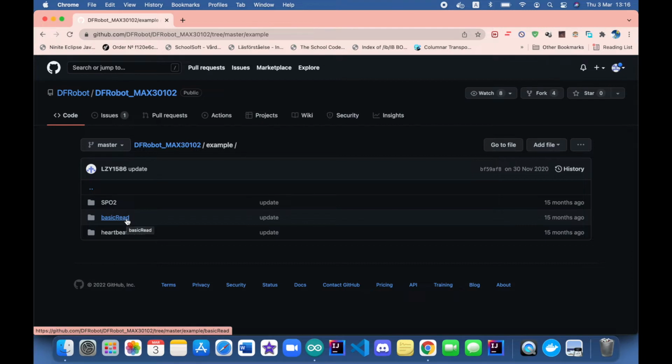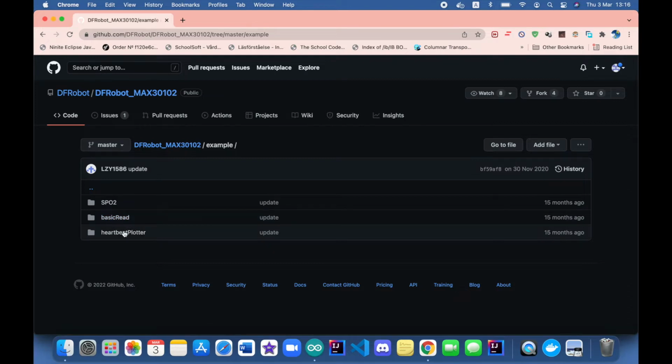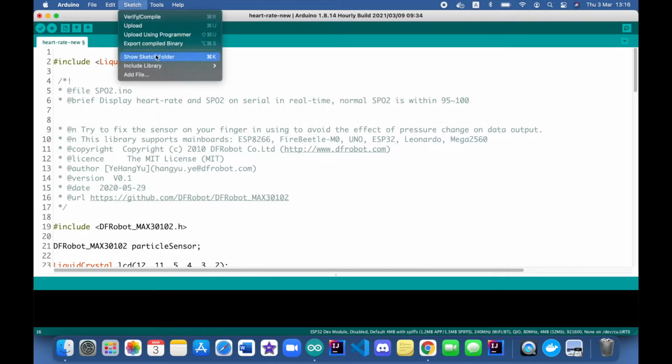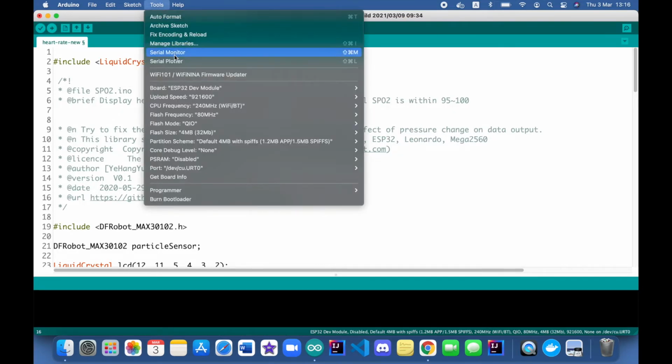Basic read just prints the number of pulses that it received. It's not actually pulses, it's beats, and this will give you a range of like 90,000 or 100,000 beats, and that's the raw data. The heartbeat plotter will plot the heartbeats inside the Arduino plotter tools, this one, the serial plotter. So you can use different outputs: monitor, plotter, or LCD.